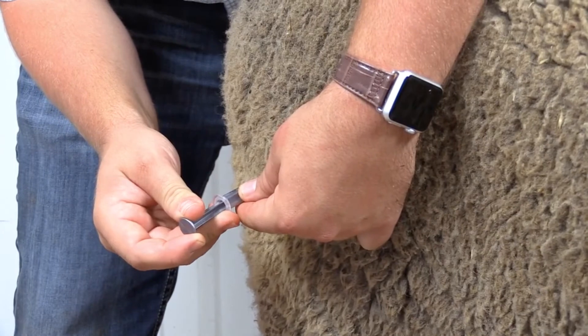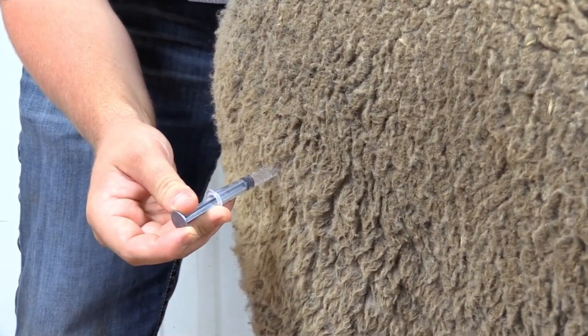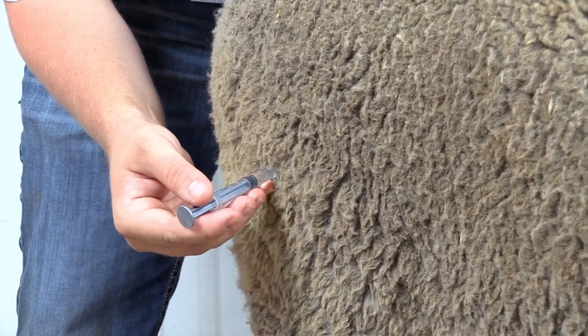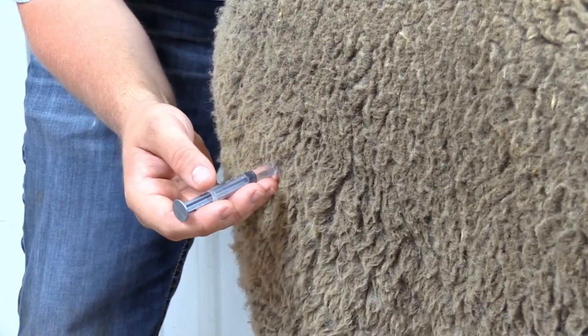We're going to pull back on the plunger. If we have hit blood, you'll see it inside the syringe, and this just means we'll have to remove the needle and try a new location. In this instance there is no blood, so we can go ahead and give her the shot.